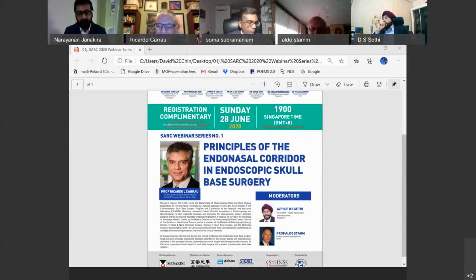And the great majority of the times, especially for tumors located in the pituitary region, suprasellar extension, even in clivus lesions, you can preserve the turbinates and the nasal septum. So basically, if you preserve the turbinates and you preserve the nasal septum on one side, of course, you can preserve the olfaction of the patient. This is very important to increase the quality of life of the patient.